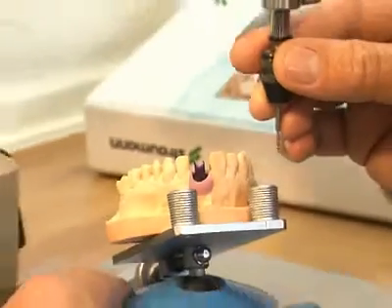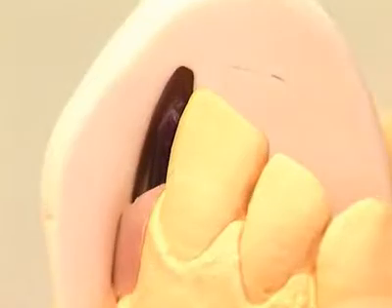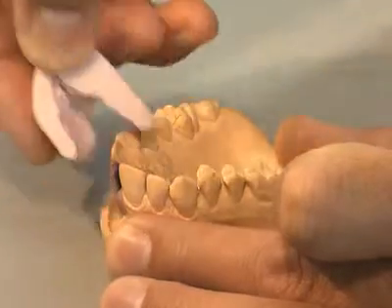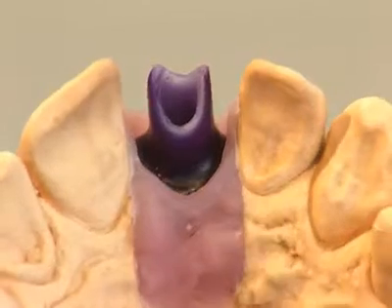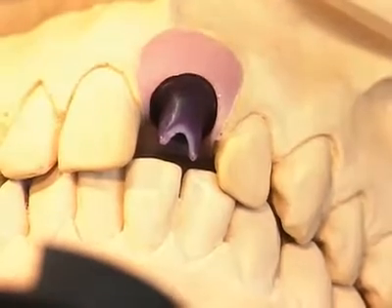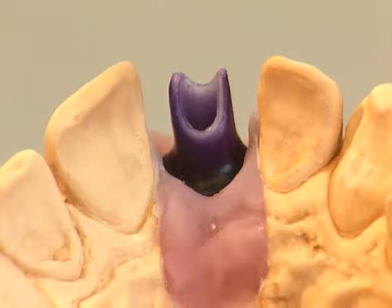The wax modulation on the abutment is examined with a silicone key to make sure that the available space is sufficient for ceramic veneering. The modulation shows an optimal design for fabrication of the customized abutment for contouring of ideal emergence profile and adaptation margin to gingival contour. For reasons of hygiene, the cement margin must be no more than 3 millimeters below the gingiva.